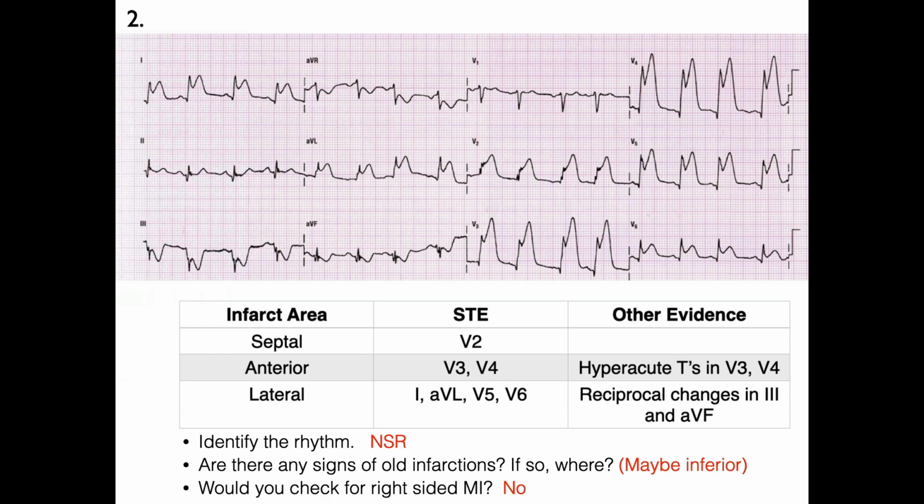If there's an inferior STEMI, you write yes. If there's no inferior STEMI, you write no. But you don't have to do that right now, okay? So, questions? There may be something in here about posterior. If you get to that, don't worry about it. We'll do it next week. And we will review these next week. We'll start off by reviewing these. Or 2 weeks, I guess.